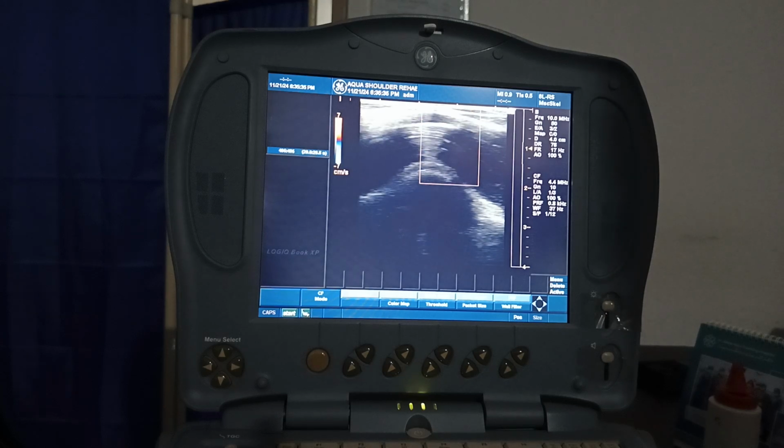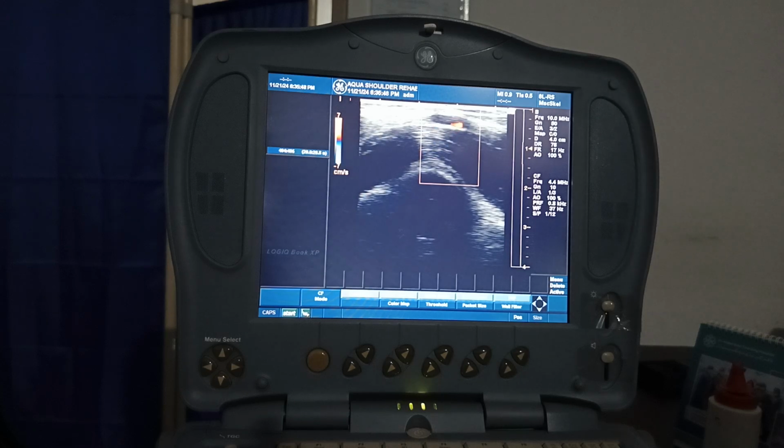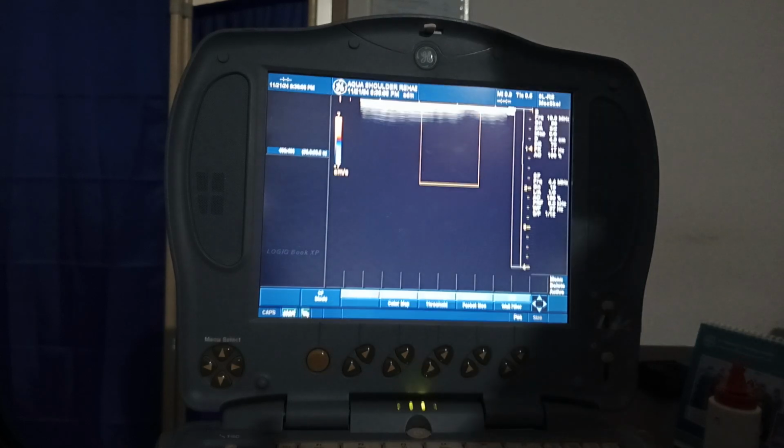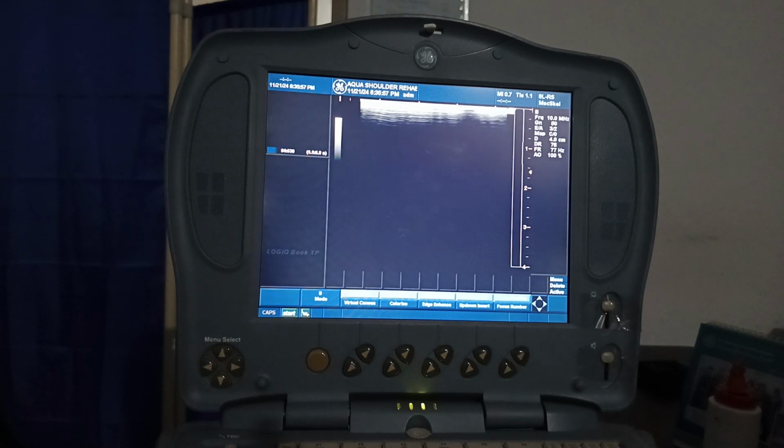and then you can somehow, of course, with one hand I can do this, but you can grab the blood vessel, visualize it, and then adjust the color flow, and then you can see this blood vessel effect using the ultrasound. So we have till now seen the muscle, the tendon, the blood vessel, and the nerve. Okay, and fascia also.